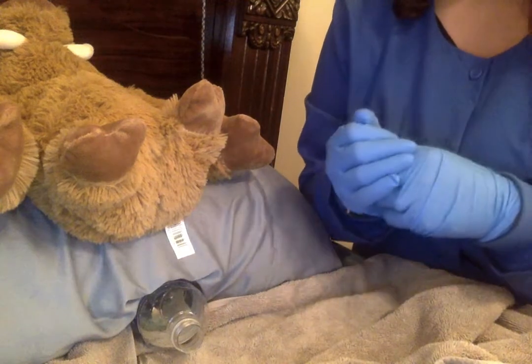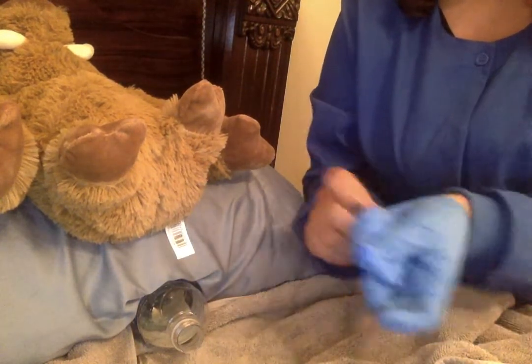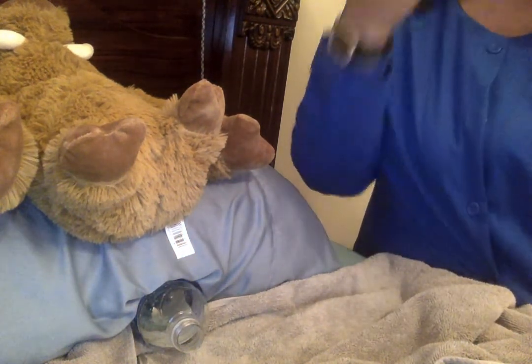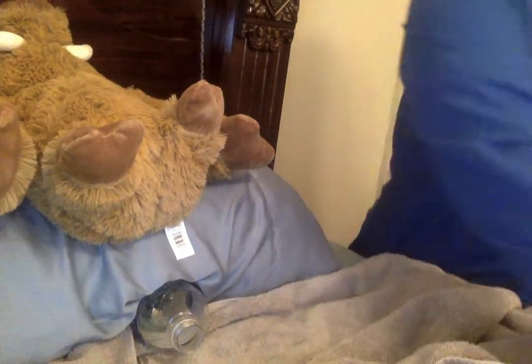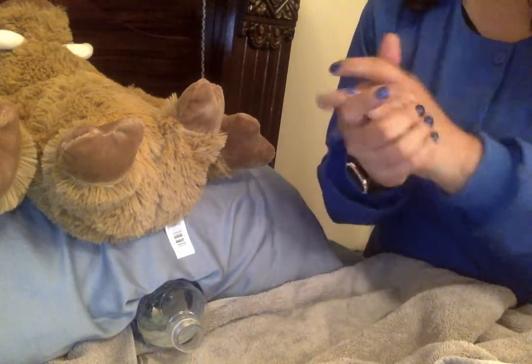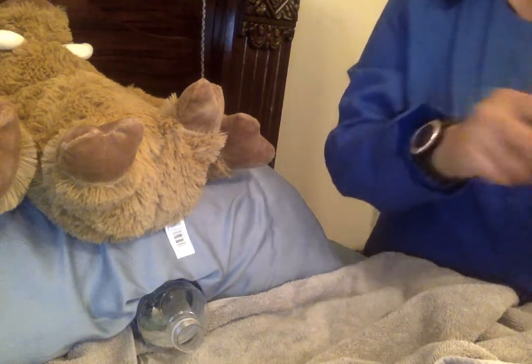And then after we're done with that, we're going to get rid of our gloves. The towel we used goes to the linen, and we're done with all that. And so we're going to perform our hand hygiene. Okay, so then we're going to start with the kit now.